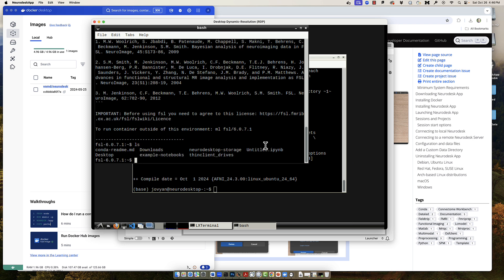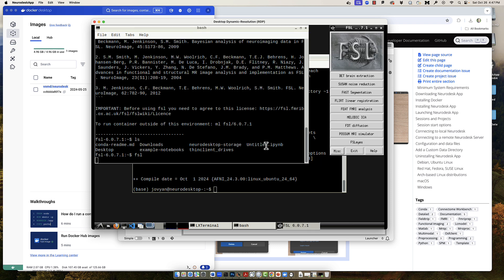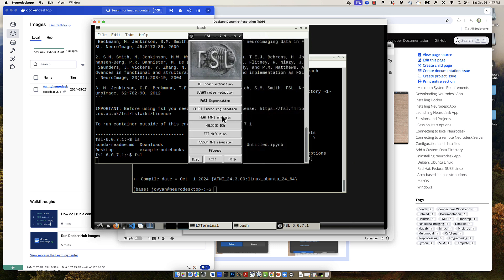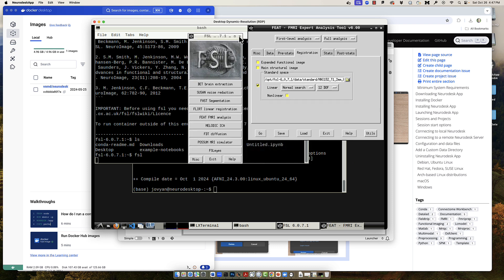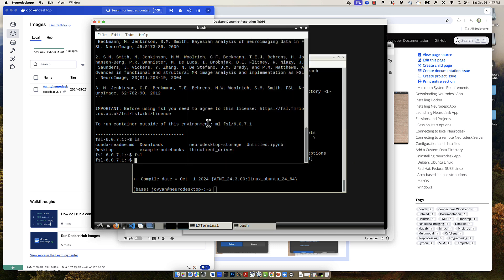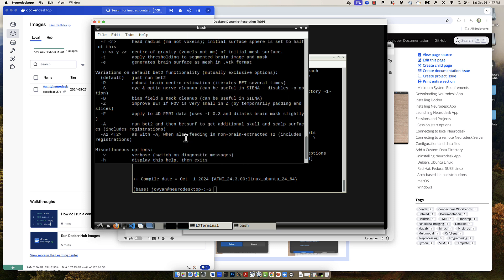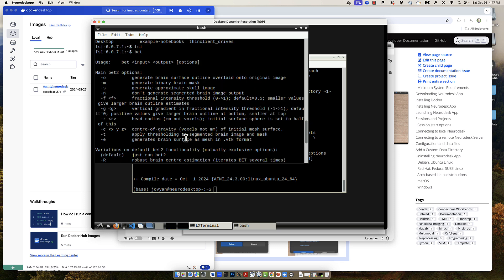In that terminal you have access to all of the commands in the FSL library. For example, we could open up the typical FSL graphical user interface, which gives you access to things like FEAT, and you also have access to command line commands such as BET, the brain extraction tool.